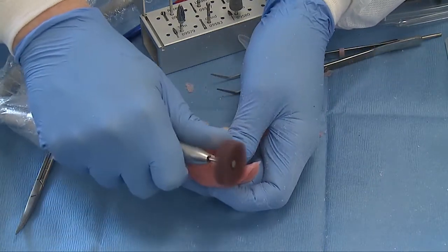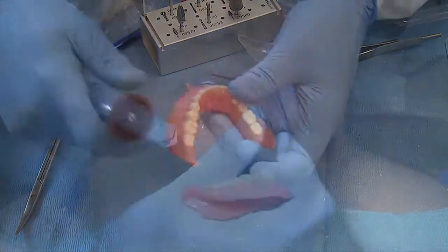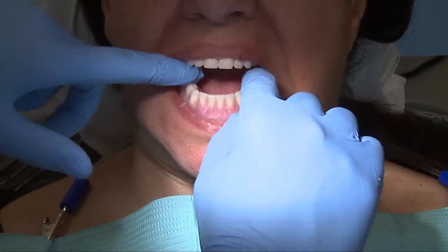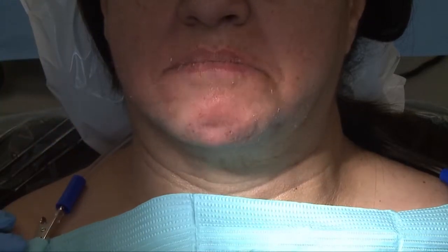For our final implant position, I'm going to take my denture, place it in, and have my patient bite down. How's that feel? Good.